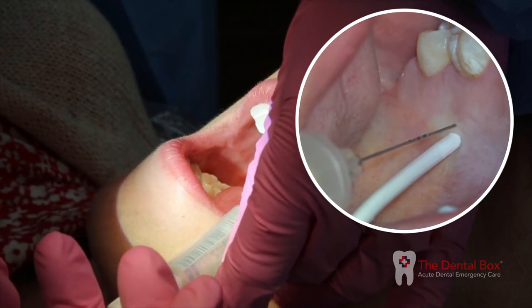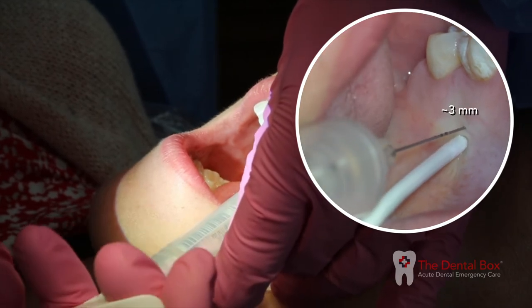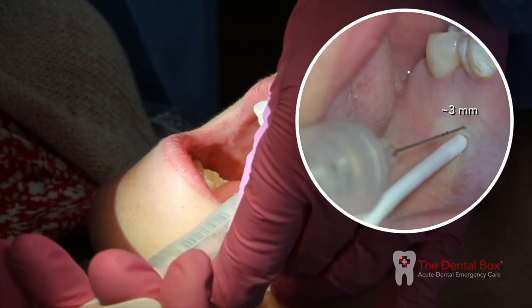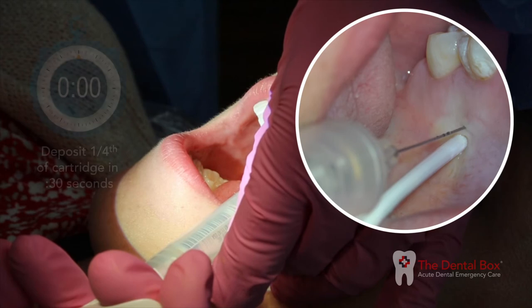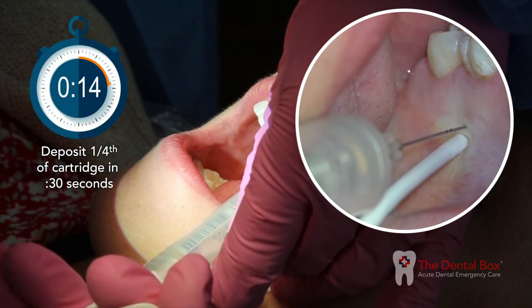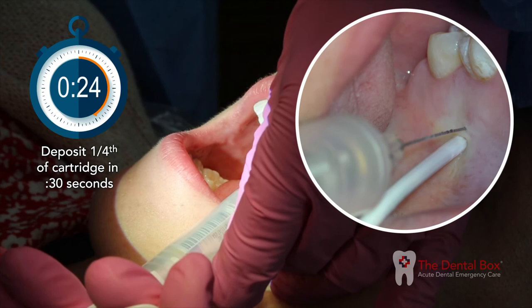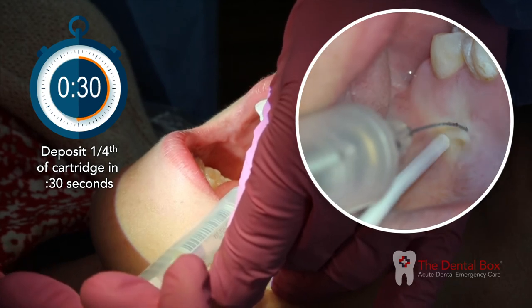Penetrate the blanched site approximately three millimeters. Aspirate syringe. If negative, slowly deposit one-fourth of a cartridge over 30 seconds. You should feel considerable resistance in the syringe.